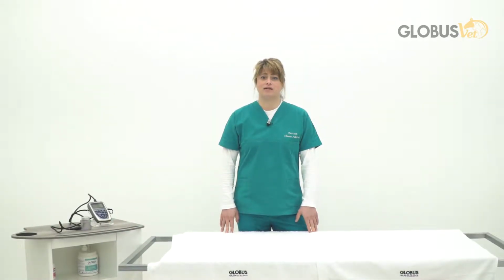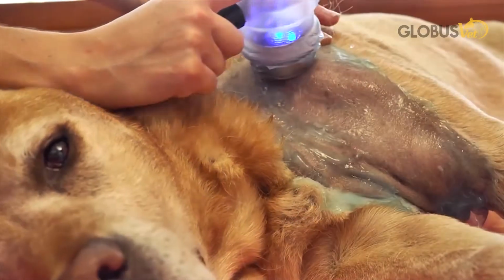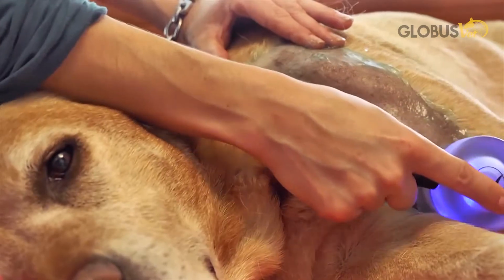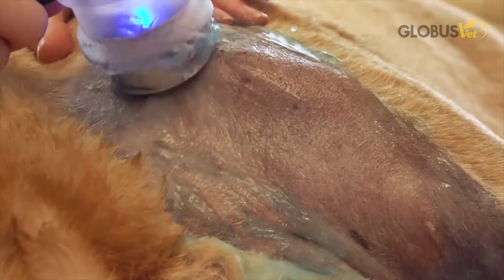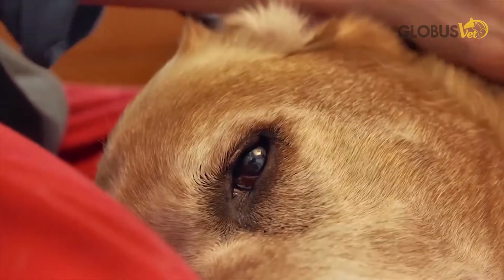When air and ultrasound get in contact without the interposition of a water-gel solution in between, and when the intensities are too high, the probe might get overheated. Moreover, keeping the probe still on a spot without moving it constantly may expose our patients to burns. If ultrasound is used on a bony prominence, the probe needs to run over it rapidly, using lower intensities.